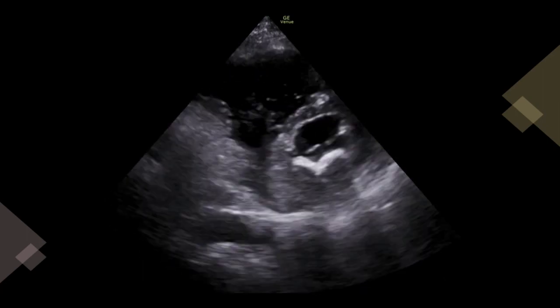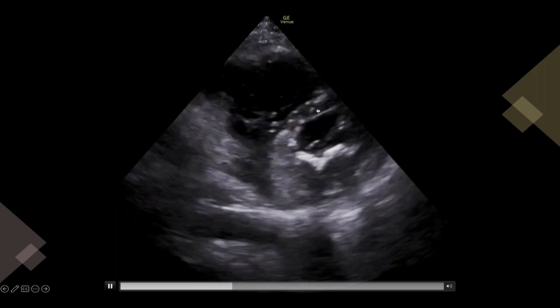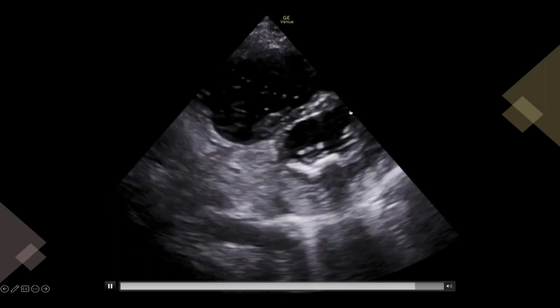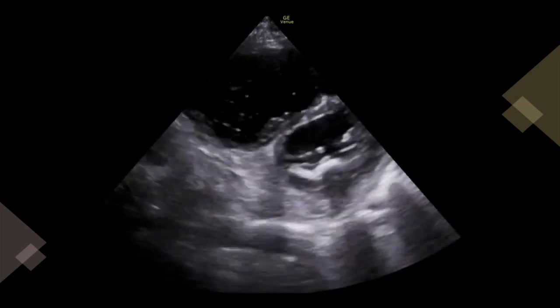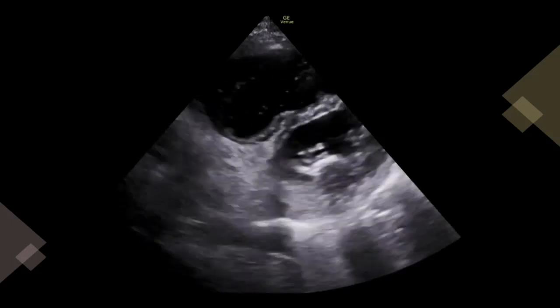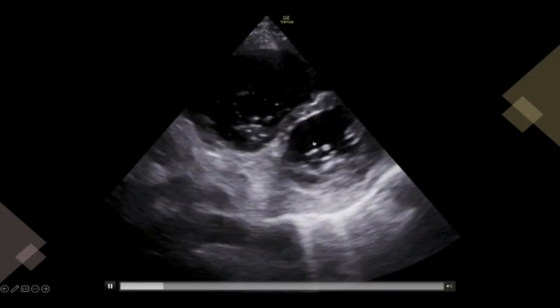The other thing that we notice here is that she has a flattening of the septum right here, causing an oblong shape of that left ventricle. The left ventricle should normally be a nice circle. It shouldn't be as flat and oblong, as in this case, so we'll talk about this a little bit more later. I don't want to give it up right now.